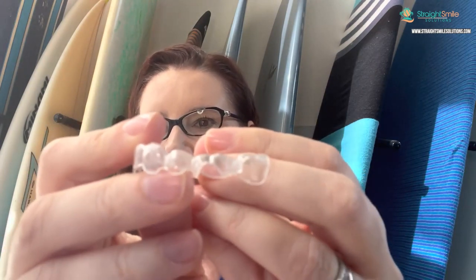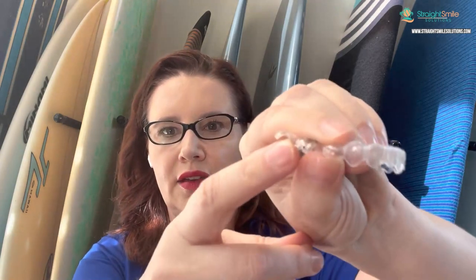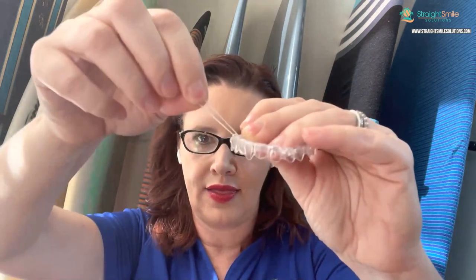If you use too heavy an elastic hooked to the aligner, it can pop it out when you yawn. When hooked to the aligner there's a little hook - we call those precision cuts. The button cutout looks like a half-moon shape, and the button gets bonded on your tooth with the aligner going over it like a little window. The precision cut looks more like a little wedge chipped out, and you slide the elastic over it. That has to be a lighter elastic because it's constantly wanting to pull the aligner out. My preference is to anchor it to the tooth itself - same concept as with braces - so I can use heavier elastics and work more quickly.